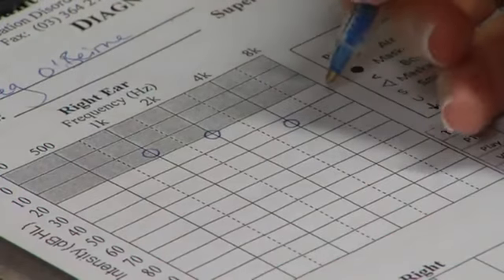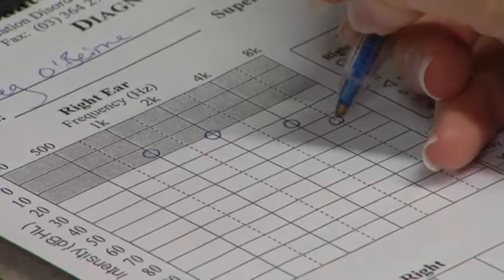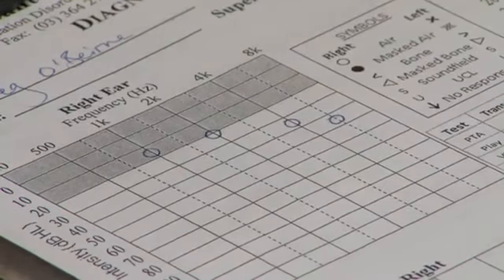Once testing is complete, the audiologist integrates the data across each of the different tests and presents the findings to the client. Right, that was great, Greg. So we're finished there. So just showing you the results. There's two graphs here for the right ear and the left ear, and they're graphs of your hearing levels. If necessary, the audiologist may provide some counselling on hearing or balance difficulties and make recommendations regarding rehabilitation or further assessments.